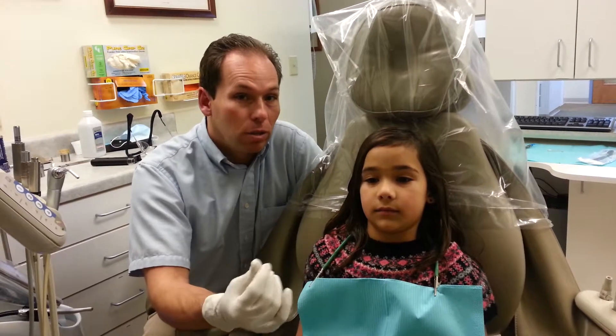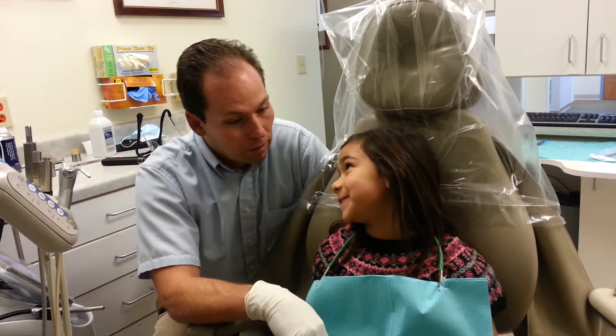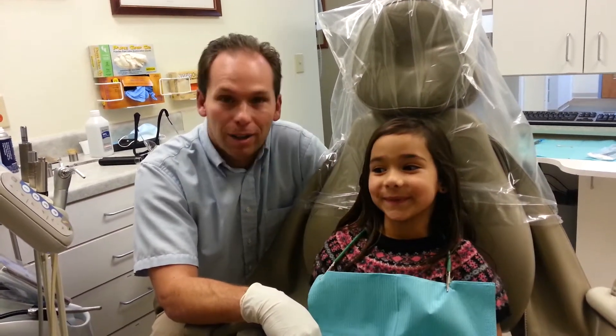Normally we just use a little topical for this, but with Rachel we're going to use a little bit of sleepy juice. So, you ready to do this? Okay.